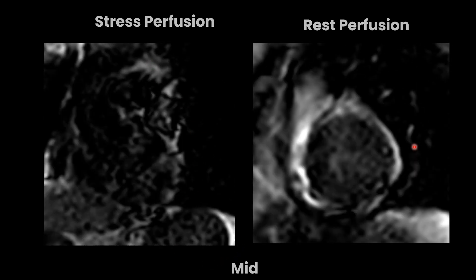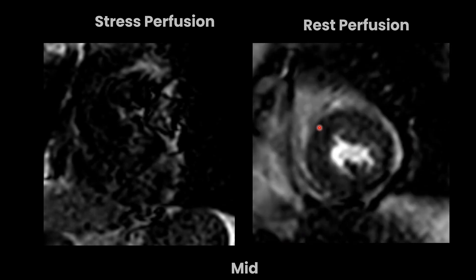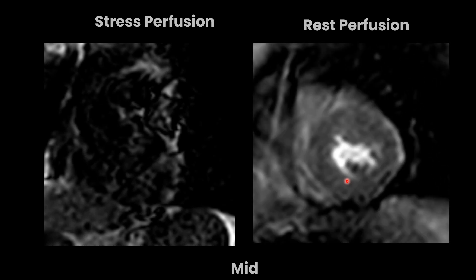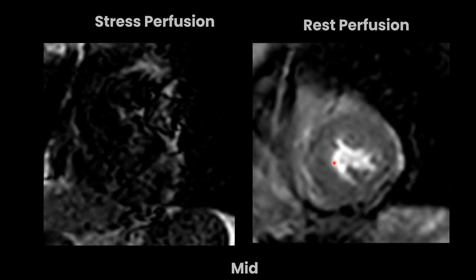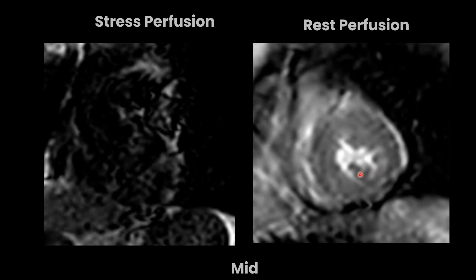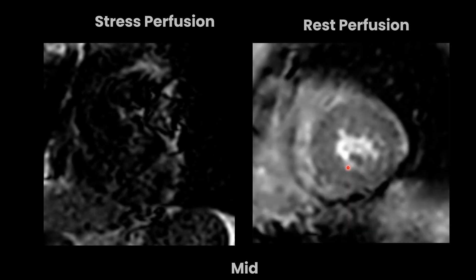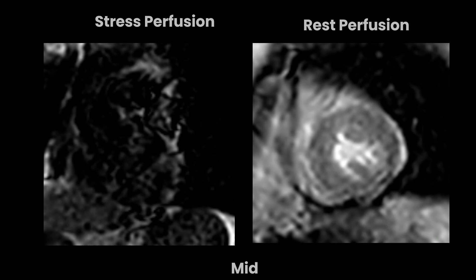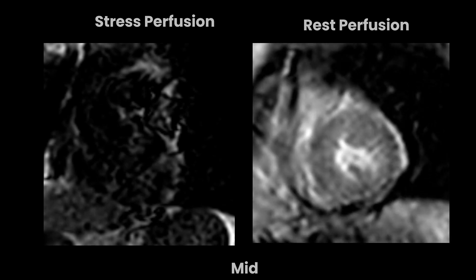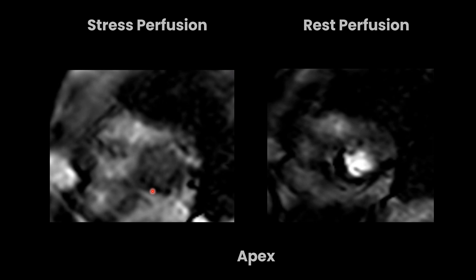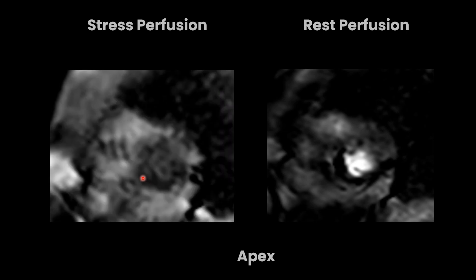In rest perfusion, without adenosine, when contrast enters the right and left ventricle lumen, there are no perfusion defects seen within the left ventricle subendocardium. This is the mid segment of the left ventricle. Coming to the apex, there is a perfusion defect which is seen here.